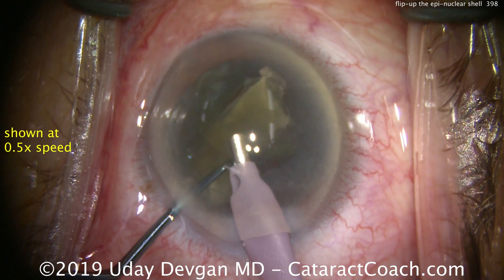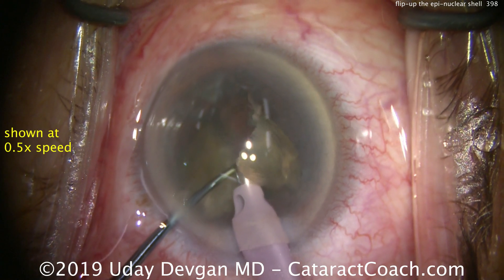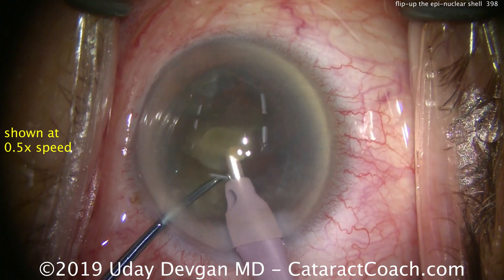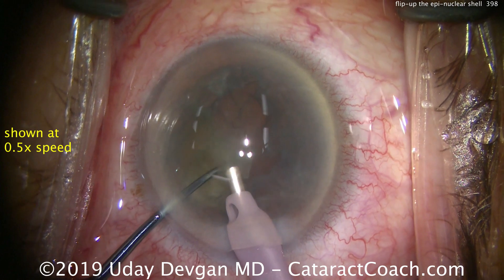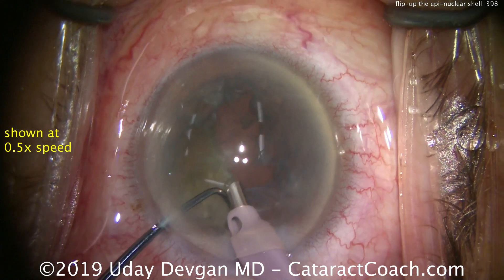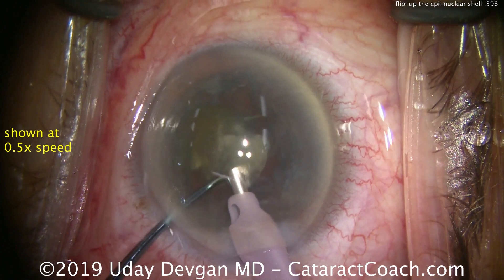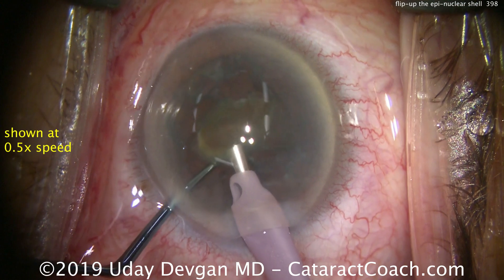Again, removing the last few quadrants of the nucleus. The key in getting the epinucleus shell is no phaco energy — we're using just vacuum, a moderate or low amount. Hold your foot still on the foot pedal; don't keep moving it up or down.